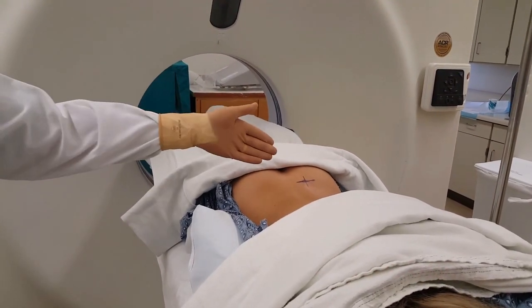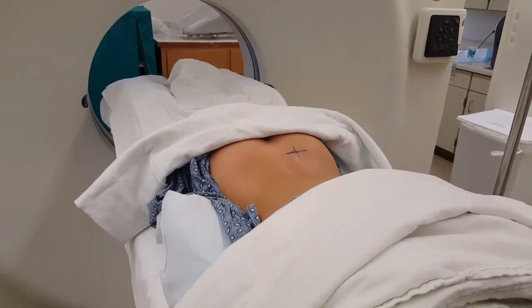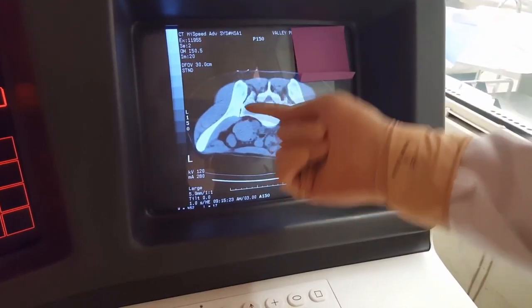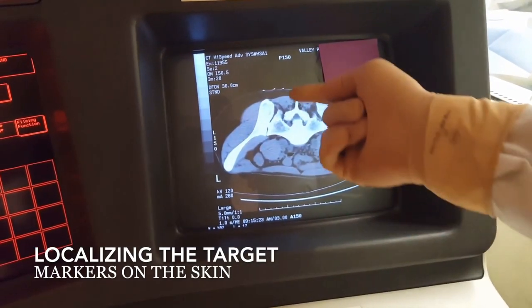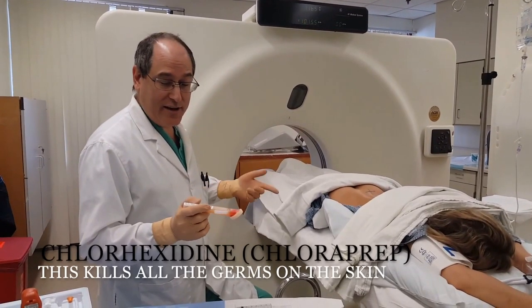Before we begin, you can see there's an X on the skin here. The way we got that there is we did a CT scan first and looked at the best spot to do the biopsy, put some metal BBs on the skin, and then did the scan. We picked the middle BB — that's where the X is.